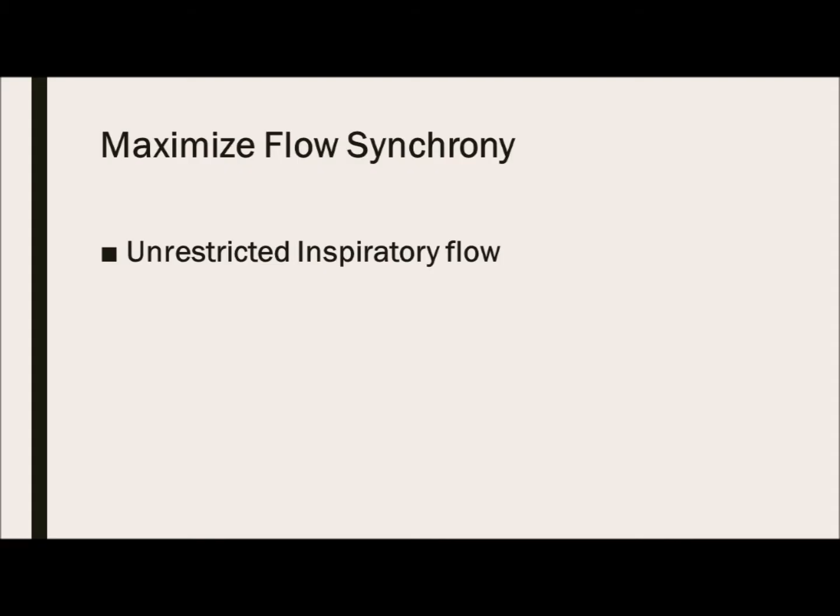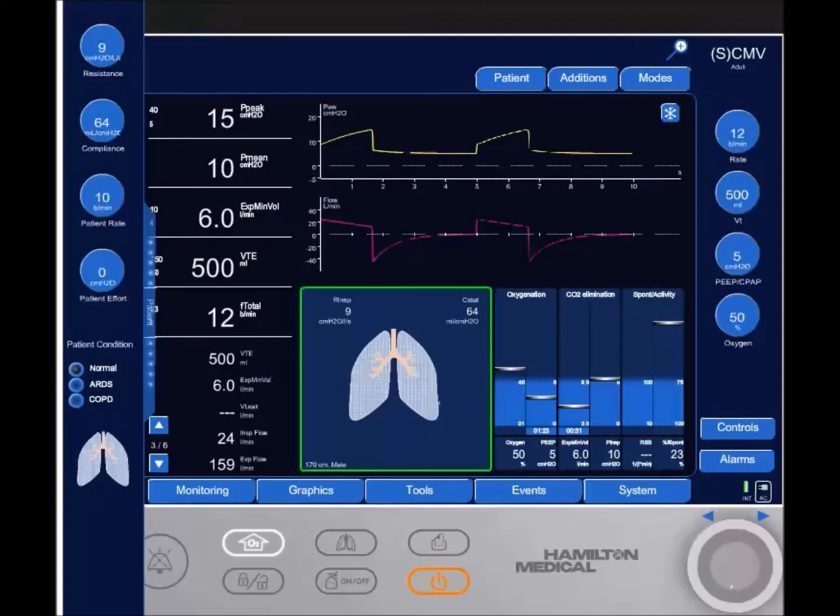Does your mode provide unrestricted inspiratory flow? Does volume control CMV with set point targeting allow for unrestricted inspiratory flow? Now, with these mandatory breaths, we can look at our measured inspiratory flow. And here's my inspiratory flow measurement of 24.